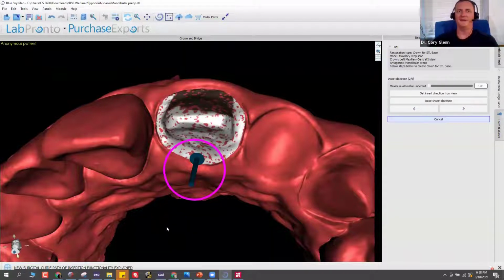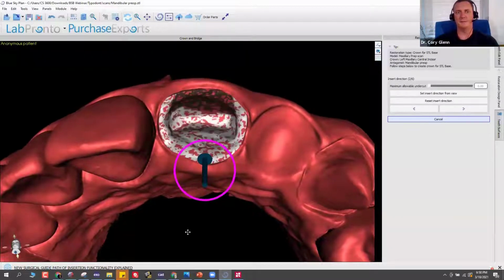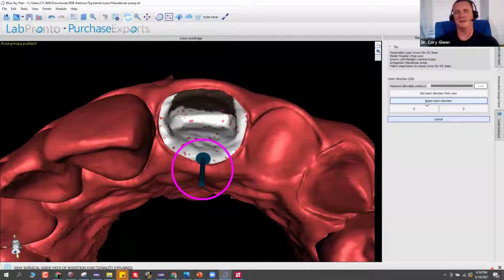With milling, it grows exponentially as you start doing more units, because it's got to actually physically remove material from these things. So you could maybe mill them out of a disc and not ever have to stop and reconfigure, but it's still going to be a very slow process. So yeah, I bet you could fit 100-something crowns on a single run if you were using like that SprintRay Pro.